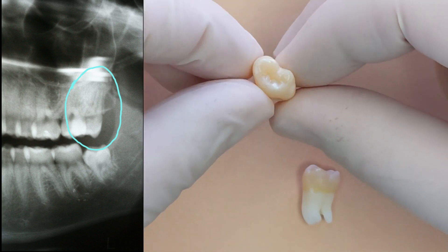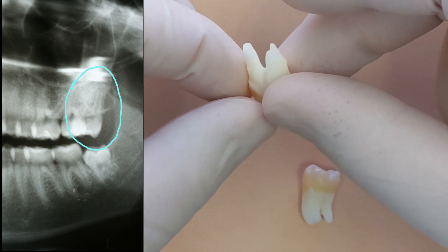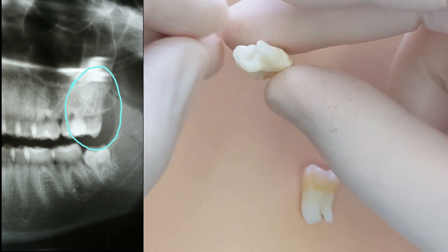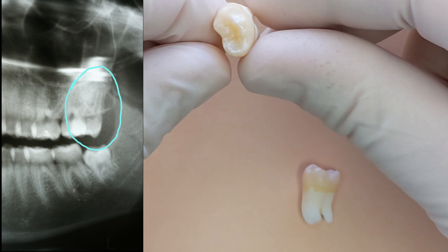This is the upper left side, tooth number 16. Again, the root tips aren't completely sealed — big, huge openings at the root tips — and just a funky shape of the crown part of the tooth. The tooth almost looks like it's a premolar more than a molar.